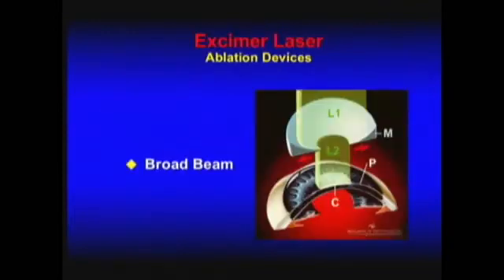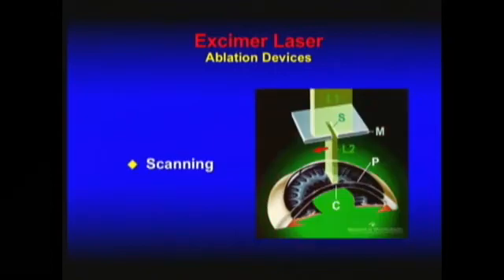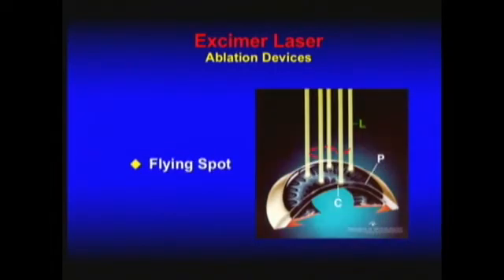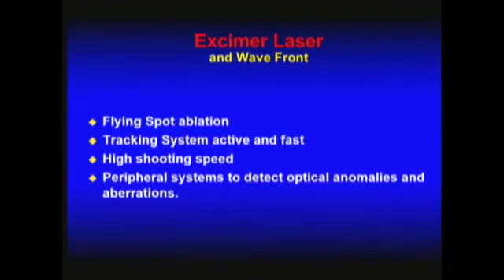First order, high orders, and to compensate that, we need special lasers, not the broad beam lasers that we had at the beginning, not the scanning lasers. We need lasers with flying spot, and not only flying spot, they need to be a very fine flying spot with high speed.